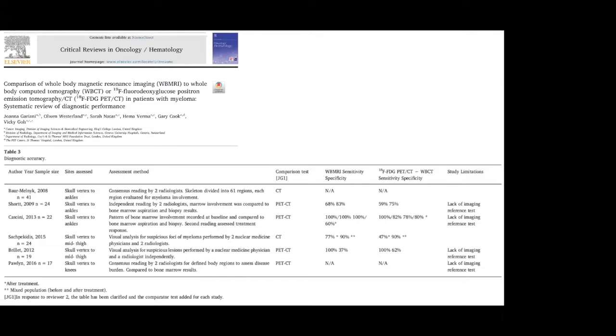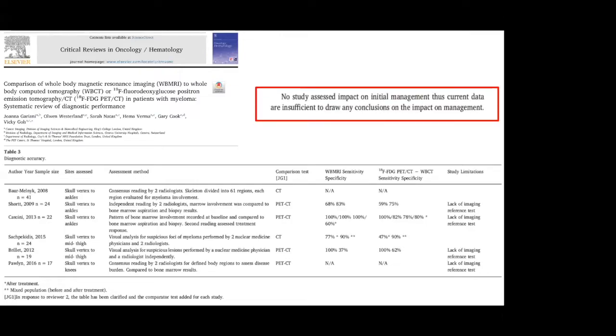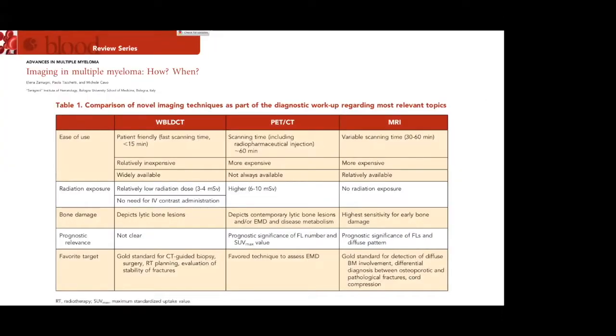But the issue is that these studies are really hard to compare because different protocols have been used. Also, the patients that got included into the studies are quite diverse and not really comparable. So that highlights that more evidence is needed to make a definite conclusion. Furthermore, not one study actually assessed the impact on management, which is also an important research question. Nevertheless, this is a study in Blood, and Blood is comparable to Radiology for radiologists.